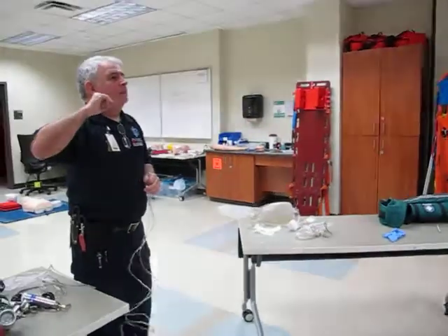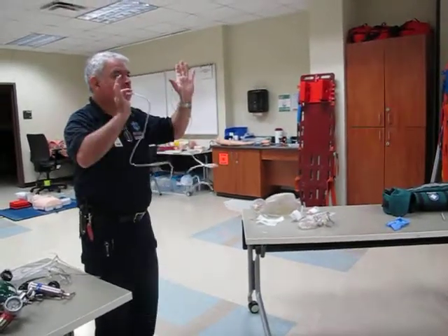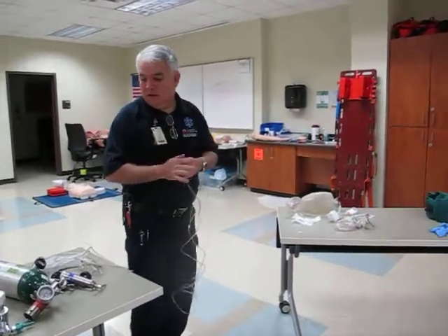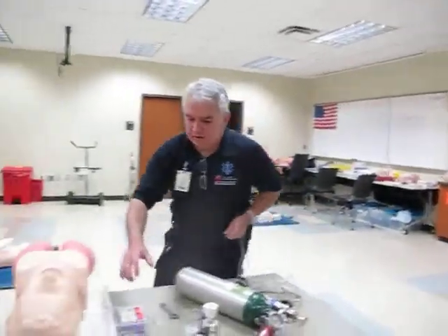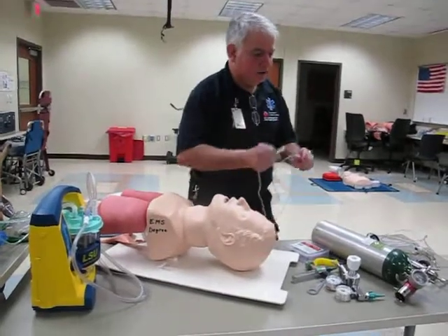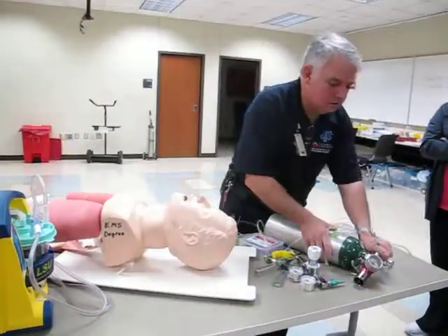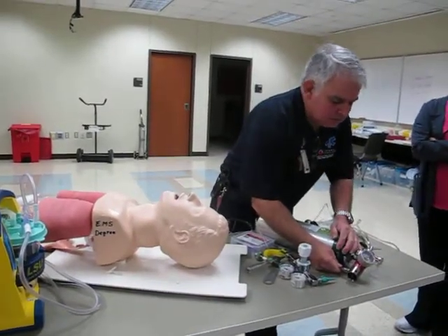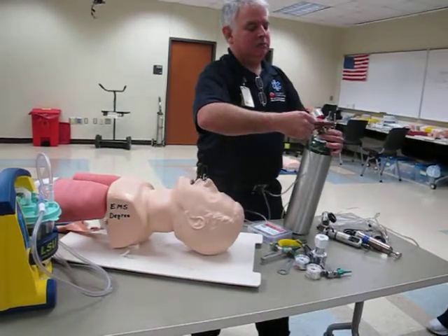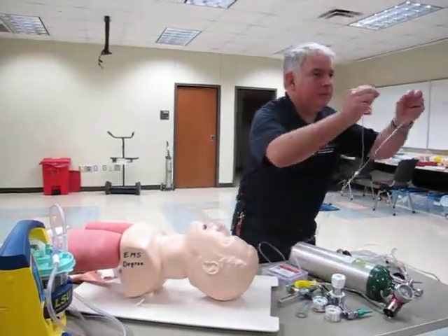To hook this up, there are a couple of rules. Don't ever have a dead device — a non-working device — on a patient. Easy way to remember it: you turn it on, then put it on. You take it off, then turn it off. That way you never have a non-functioning device just sitting on a patient. So I turn this on — I already have my oxygen tank set up. Hook it into my Christmas tree with a gentle push; it's rubber, you don't have to crank it. I'm going to dose this at, say, 4 liters per minute — can you hear it?